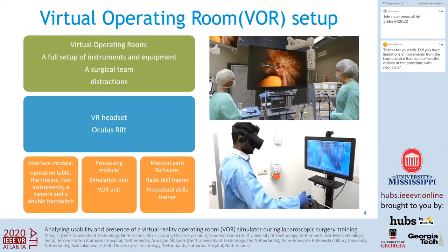The VR setup we applied comprised three components in this study: a VR laparoscopic simulator, a VR headset, and a virtual OR environment. The main drawback of current VR laparoscopic simulators is the lack of a true representation of the operating theater experience. Most VR laparoscopic simulators use a 2D display that replicates the tasks, but not the busy and chaotic environment. In this study, we simulated different kinds of distractions.